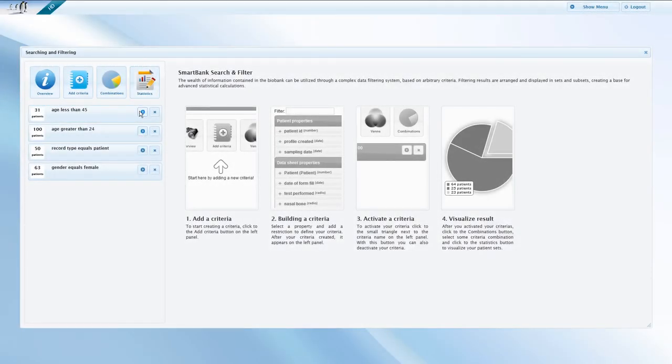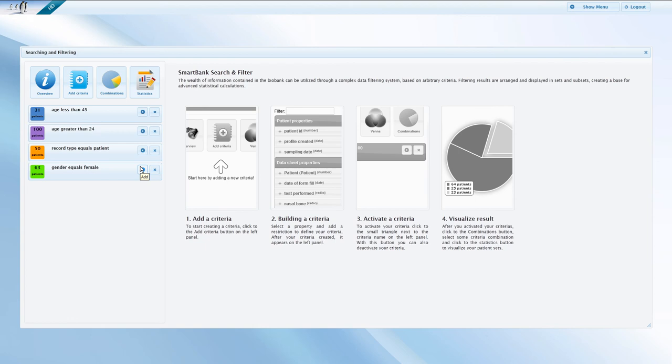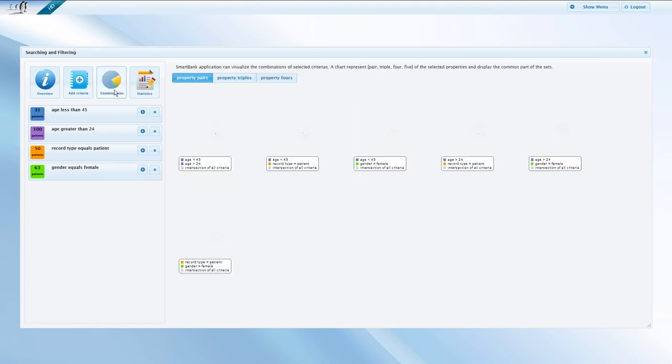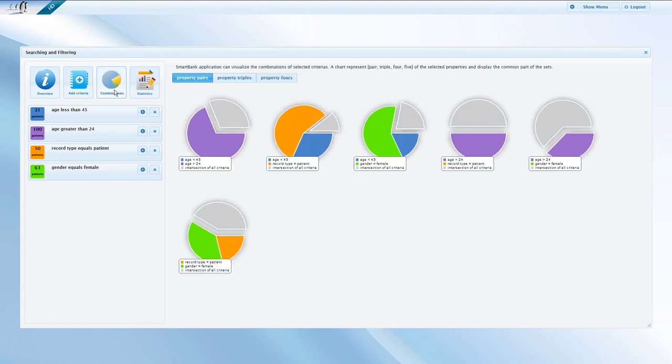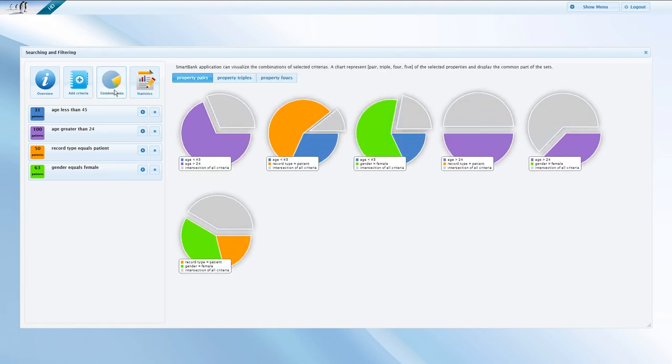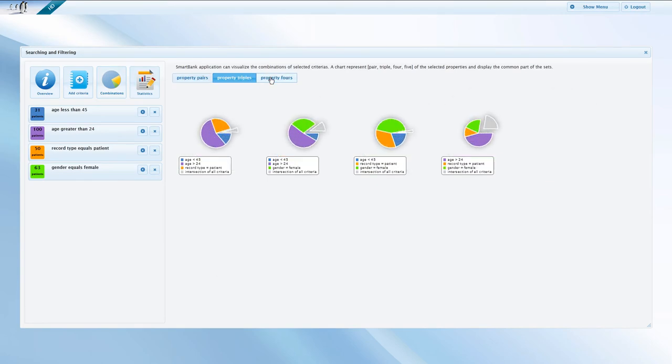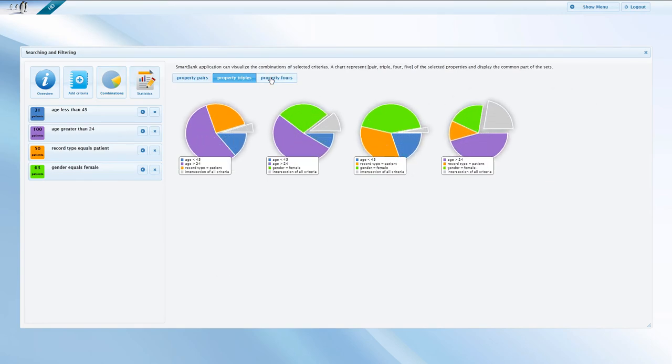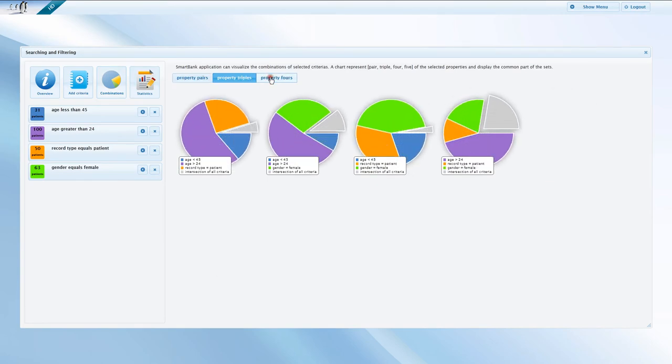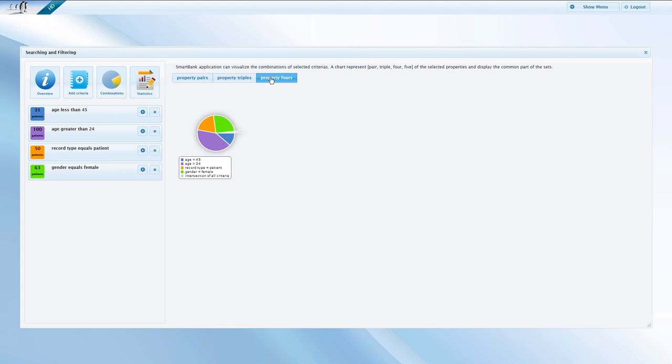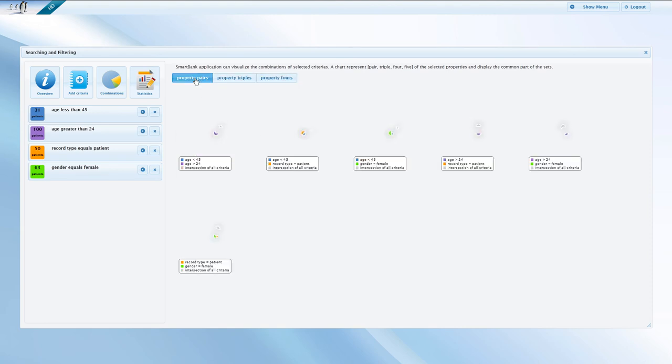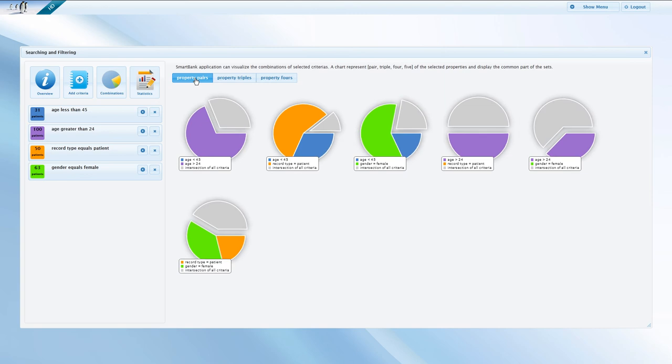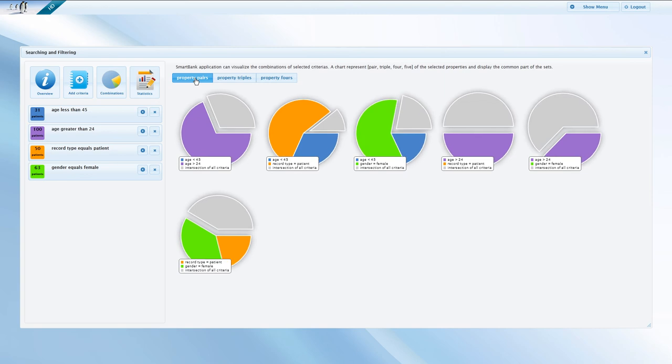The arrow button next to the cross allows you to create combinations of the different criteria. A certain color will be immediately assigned to each chosen criterion. After selecting the required criteria, click on the combinations icon to display the particular segments. The displayed pie charts show all possible combinations of the selected criteria. The meaning of the colored areas are the same. The only difference is the number of individual criteria displayed in the chart.